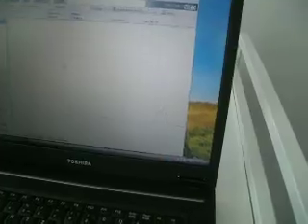That would mean that if I press start here, I can leave the patient and the whole system alone. It will automatically perform 3 consecutive measurements with 10 minutes differentials. That would take a study as long as 30 minutes. So that was a quick start guide how to handle Arteriograph. There are some finer little details which you can access from the user's manual of the Arteriograph.